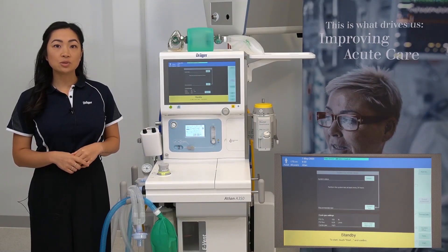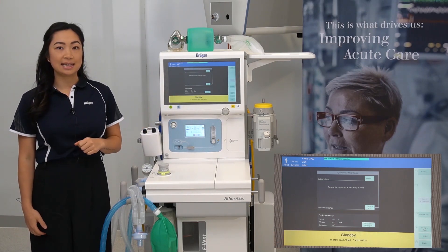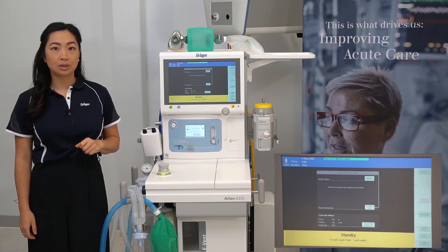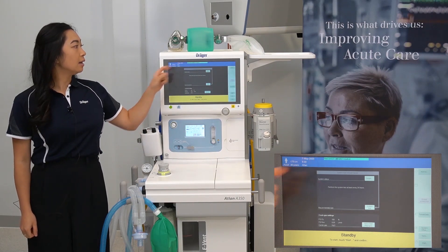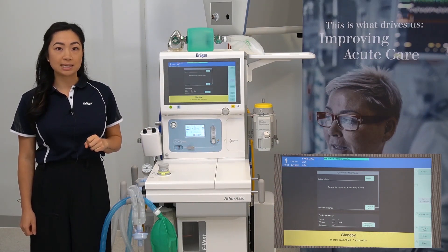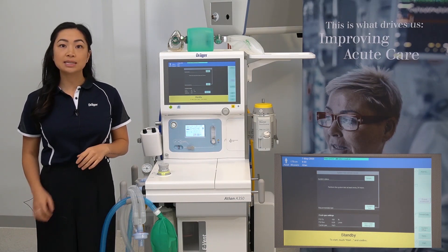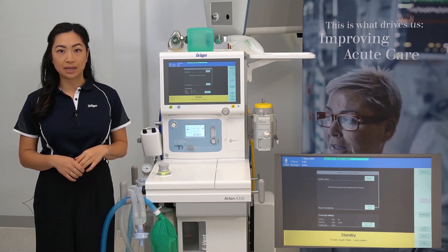Your device will power on to this screen seen here. You'll notice a grey banner saying system has not been tested. You'll also see displayed a blue technical message advising that flow sensor calibration is required. This will be displayed until a system test has been completed.